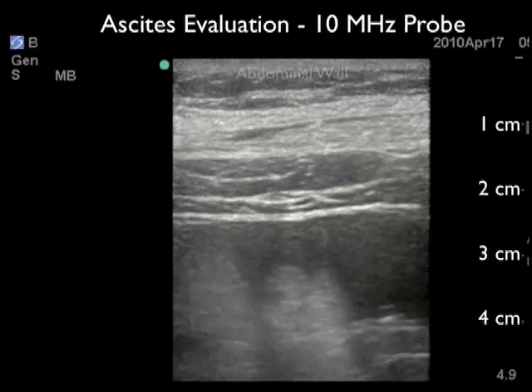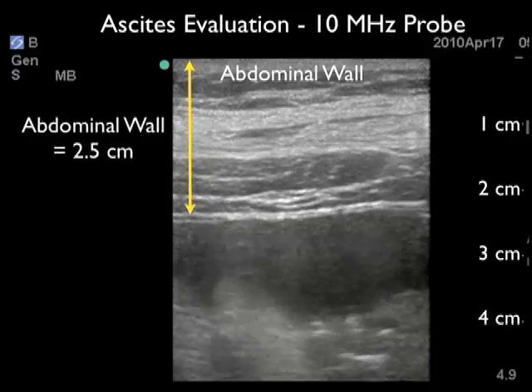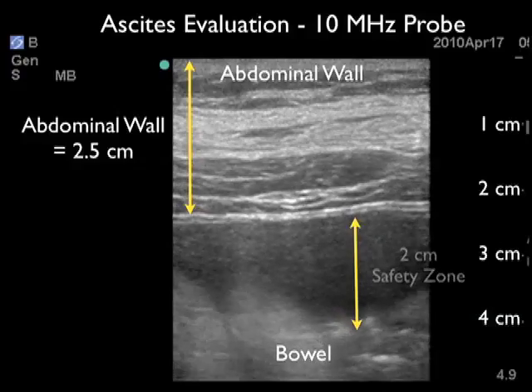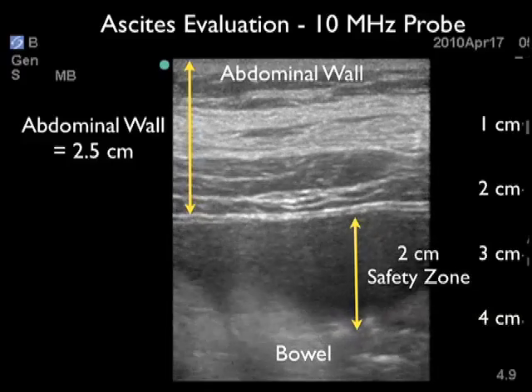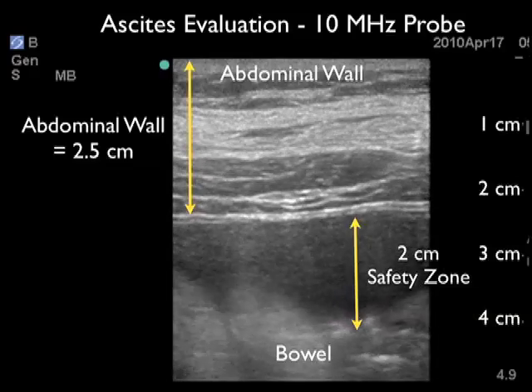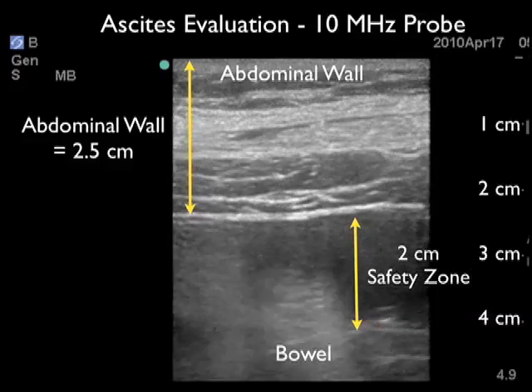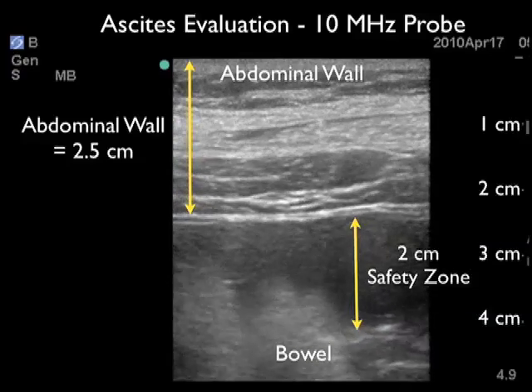Another benefit of using the higher frequency probe prior to paracentesis is to investigate the depth of the abdominal wall, as a thick abdominal wall can frustrate attempts at the procedure. Here we see the depth of the abdominal wall measuring 2.5 centimeters anteriorly. We can see the peritoneal lining just deep to the abdominal wall, and ascites — the dark fluid collection — just deep to the peritoneal lining, with gut sliding or bowel moving back and forth deep within the ascites. Note the 2 centimeter safety zone; however, we need a needle longer than 2.5 centimeters just to get through the abdominal wall.